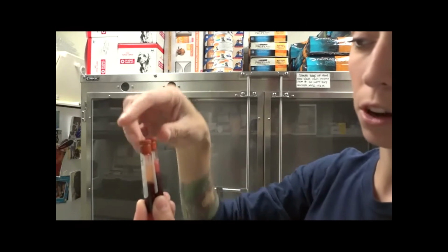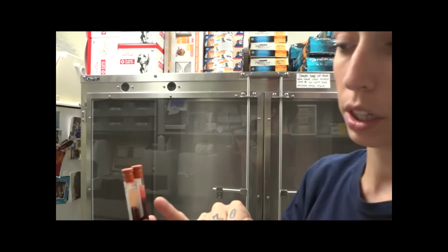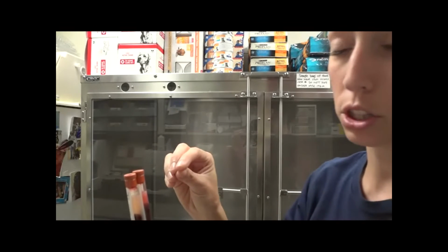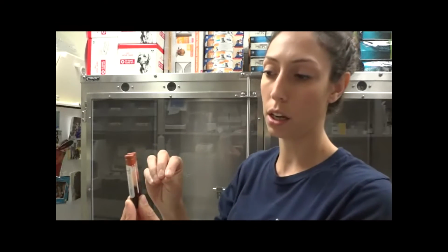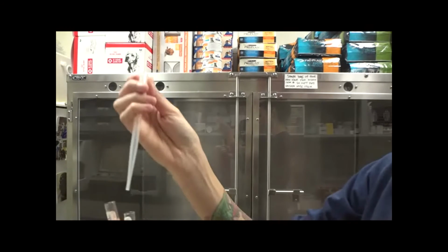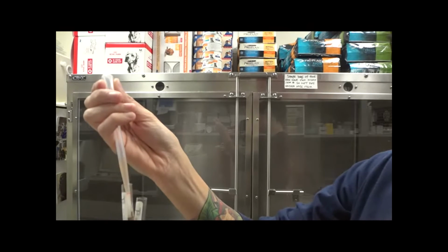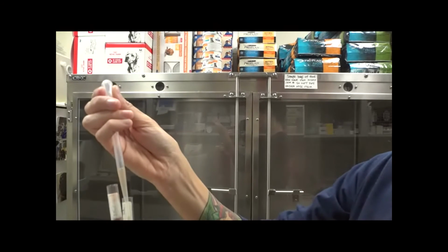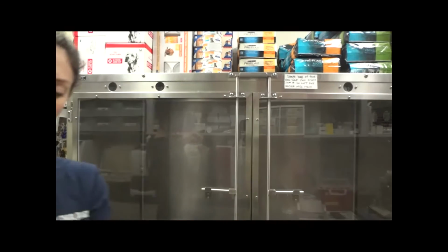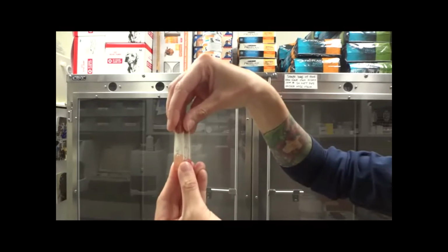Alright, here we have our red tops that have been centrifuged, and we can see our serum here. We're going to pipette that serum out of the tubes and place them in new red top tubes with no additives. Here's both the recipient and donor's serums.